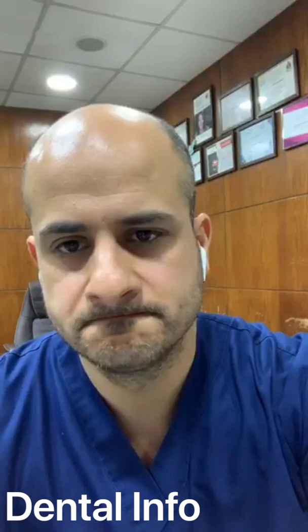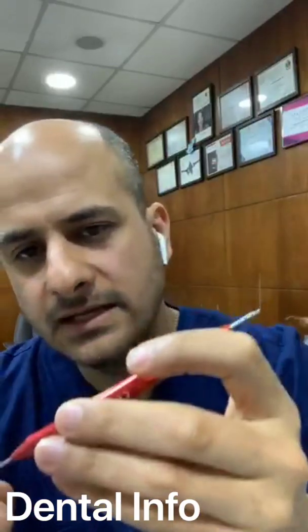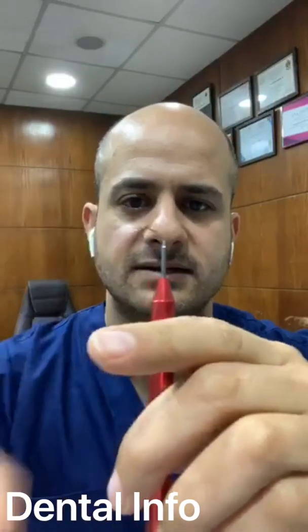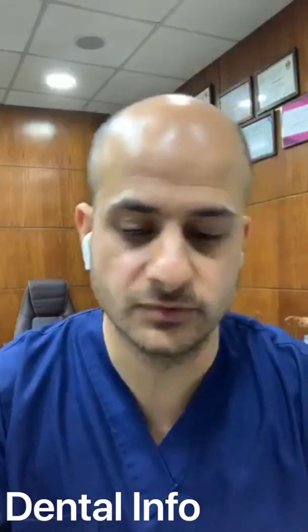Okay. What do you think about nickel titanium pluggers? Yes. For example, here I have this plugger from Fanta. It has two tips. One stainless steel, and the other one is nickel titanium. See, you can bend it. Okay. Of course, you can use it if you have good experience. Why not? Hope you have tried your hands.